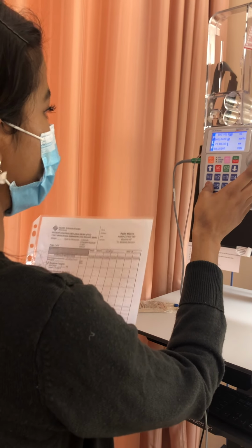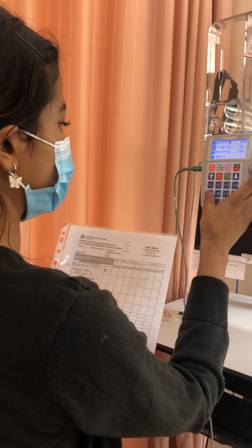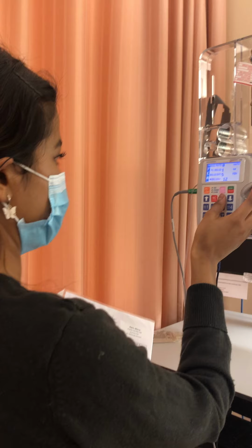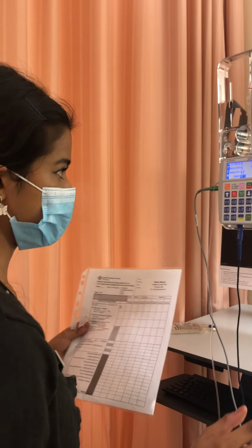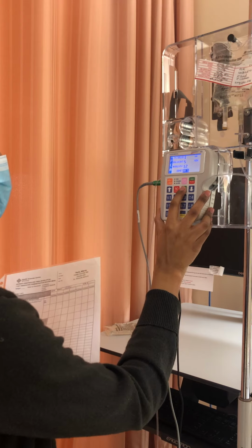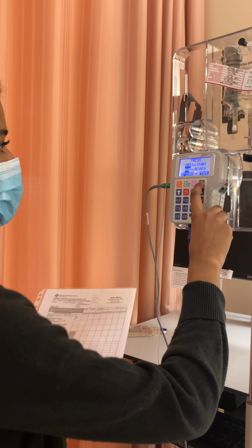Bolus interval, so 5 minutes. Yes for that. And then they're going to be receiving 12 boluses per hour because 60 divided by 5 is 12. So yes for that. And then I'm going to get a second nurse to double check everything before I click start and do an independent check. So a second nurse has done the independent check with me, so I can go ahead and press yes. And I can go ahead and just press run.